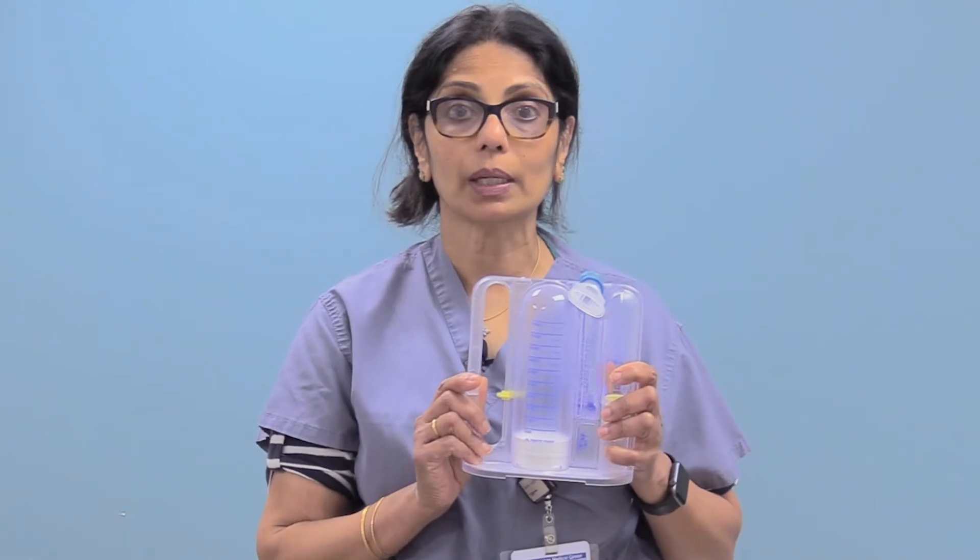My name is Anna and I'm a registered respiratory therapist at St. Barnabas Medical Center. This is an incentive spirometer, also known as an IS, a device that will keep your lungs healthy, especially after surgery.